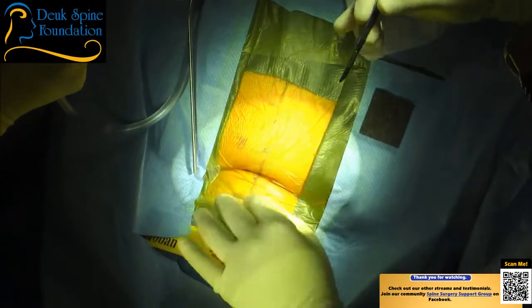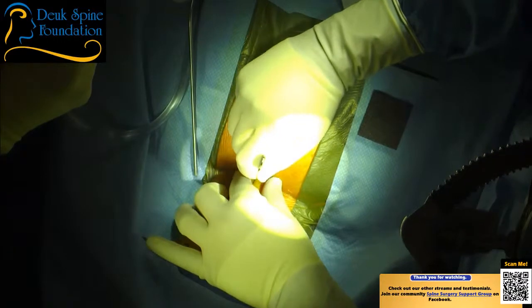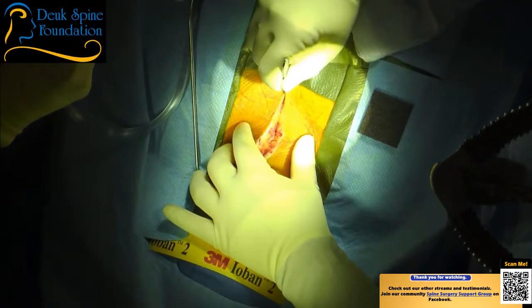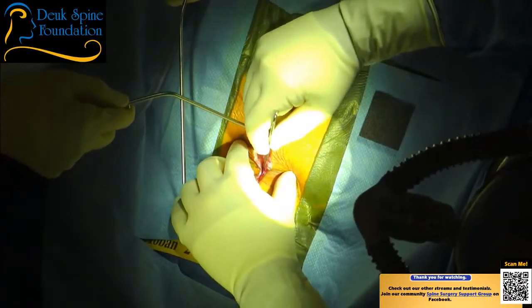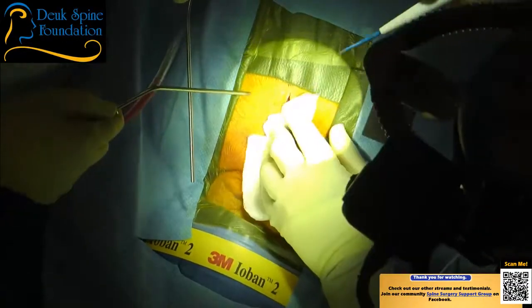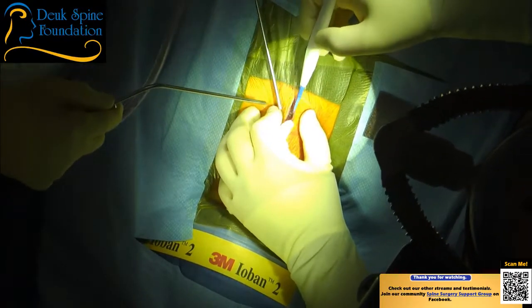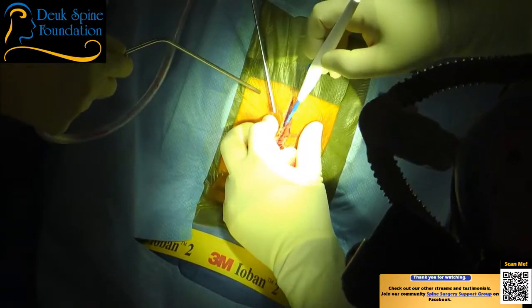This is the skull of the patient. We want to be just below. Now, we're not using x-ray during this surgery. Some surgeons use x-ray, some don't. The x-ray would be used for localization as well as placement of implants. The implants we're going to put in today are cervical lateral mass screws and rods. We also are going to localize, but the way I localize for these surgeries is I use the patient's anatomy. So we're going to find the spinous process of C2 up top, and we're going to find the transverse process of T1.